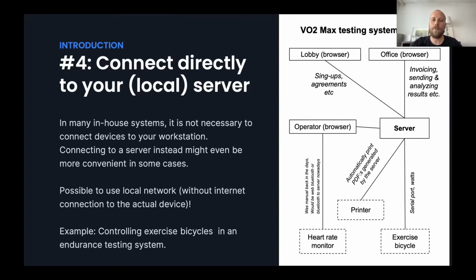We were actually using heart rate monitors as well, but at that point, these were still not using Bluetooth connection, but a custom tailored connection, and we couldn't automate that. So in this system, we actually had a manual interface to fill in the data from the heart rate, and that was probably the biggest part. So the operator needed to type in a lot of numbers from the wrist computers to complete the test.